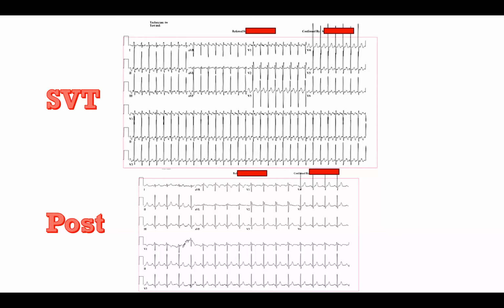But I would probably assume that if they're showing the 12 lead, they probably want you to interpret what's in the 12 lead as well. Many years ago, when I was taking my board recertification exam, they showed a case of an 18-year-old Fontan patient who was tachycardic, and they showed the intracardiac tracing, and they wanted to know what the arrhythmia was.